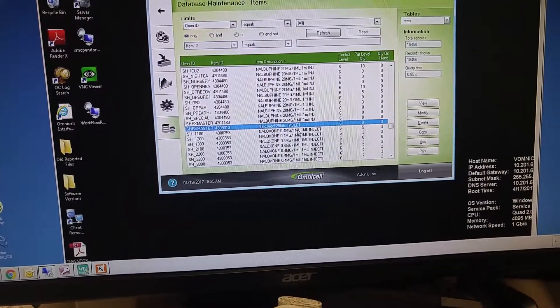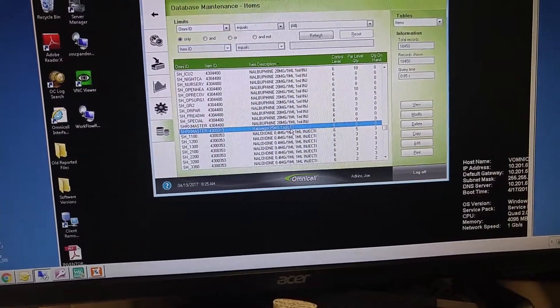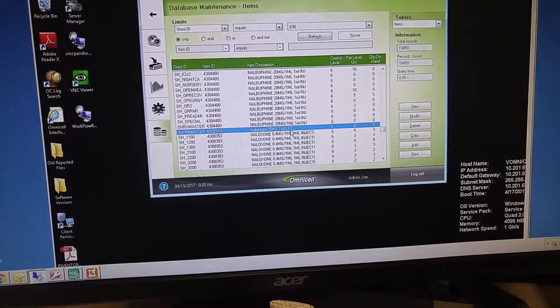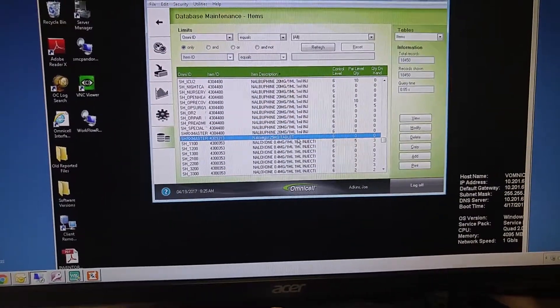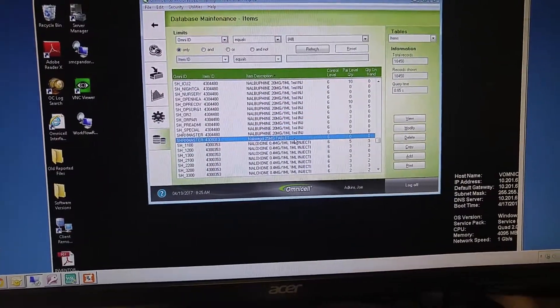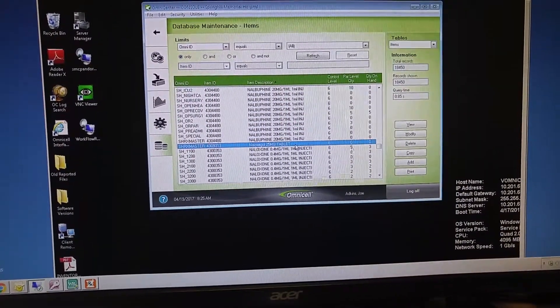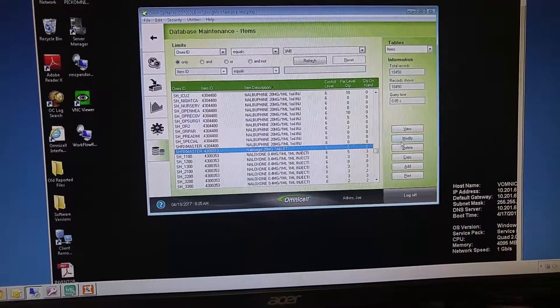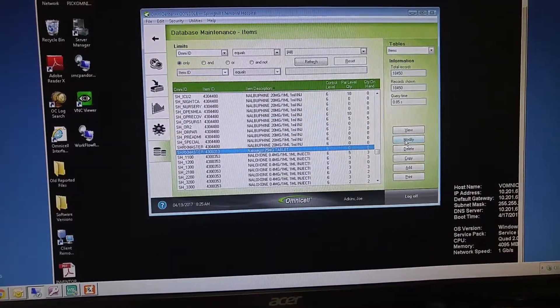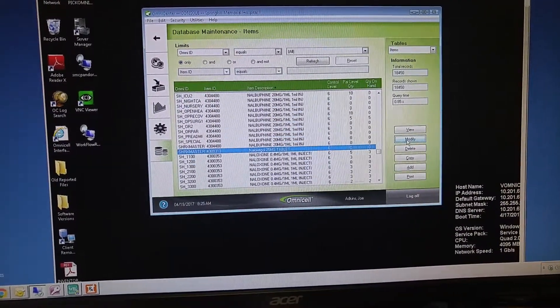If there happens to be more than one, you can choose any of them. The barcode will be added to all the items, even if you add it to just one. So highlight that item, and we're going to hit Modify.